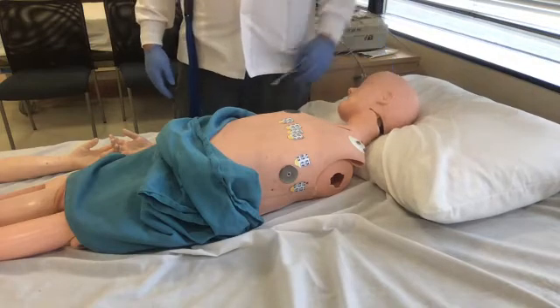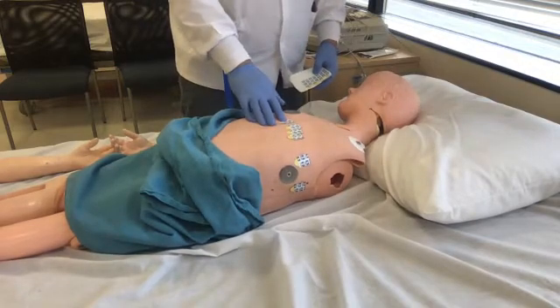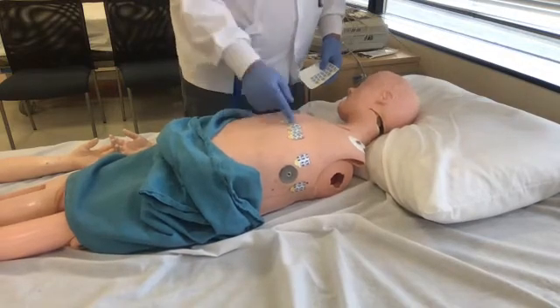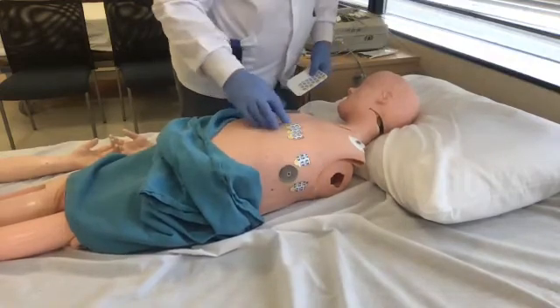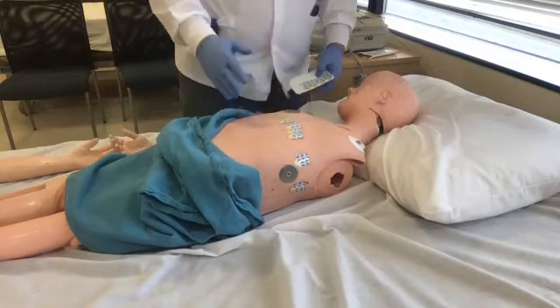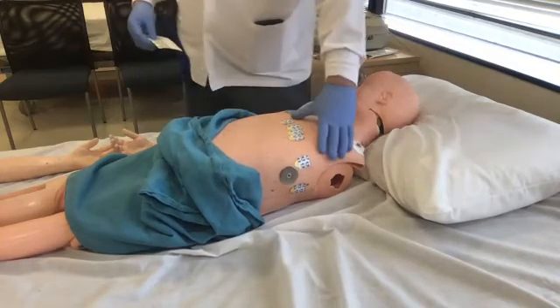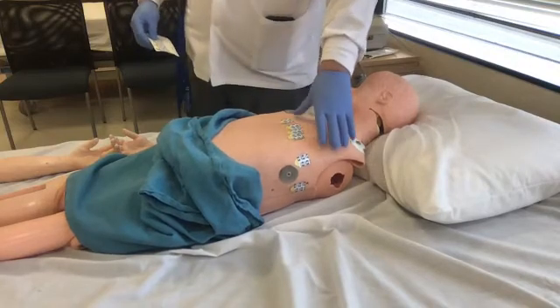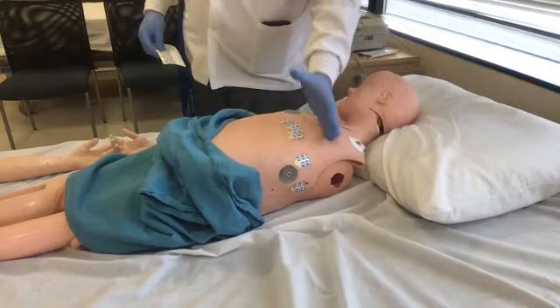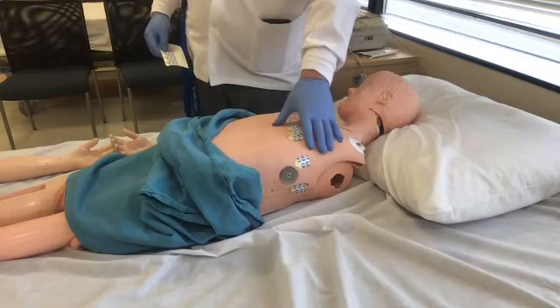And this is how my mother did. But you know what? Years and years of doing this, right? She measured up the first one and then did what? Because here you see the arc is very subtle, because if you look at your rib cage, it's subtle. Now, here we have a non-obese patient. It gets tricky when it becomes female and you have a lot of breast tissue.